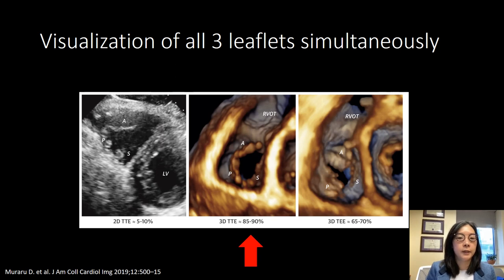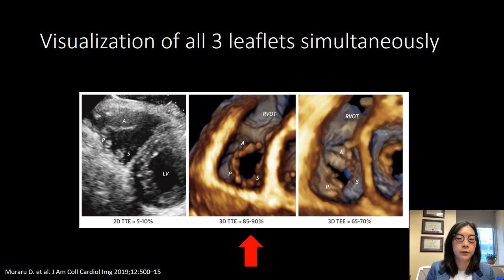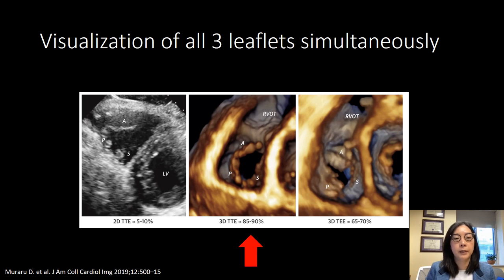3D echocardiography is very useful for looking at and identifying all three leaflets simultaneously. With 2D transthoracic imaging, only about 5 to 10% of the time will you be able to see all three leaflets in a single image. With transesophageal imaging, about 65 to 70% of the time — simply because of the anterior location of the tricuspid valve in the chest, making it very far from the probe and challenging to image. Transthoracic 3D imaging is very ideal because of that location, and about 85 to 90% of the time with transthoracic 3D imaging, you'll identify all three leaflets in a single view.